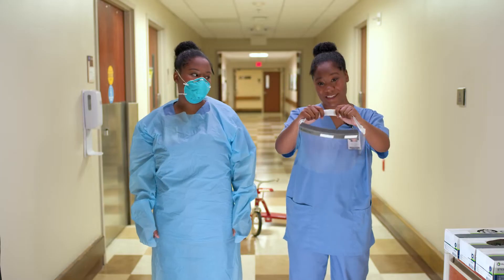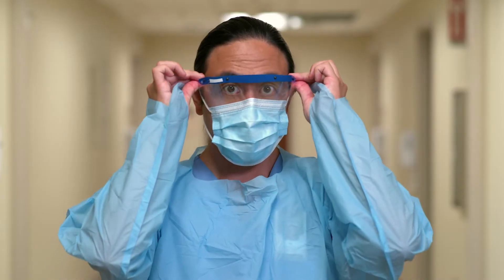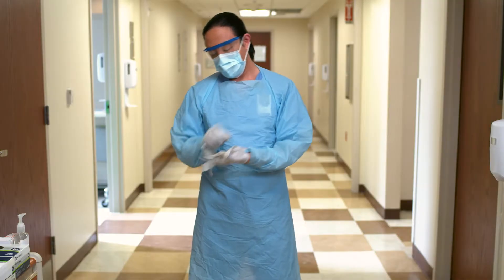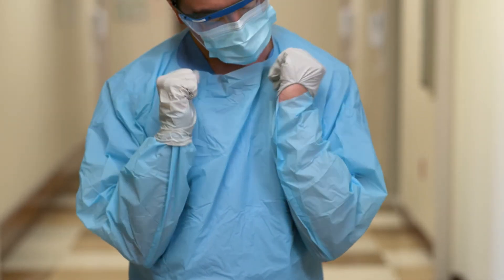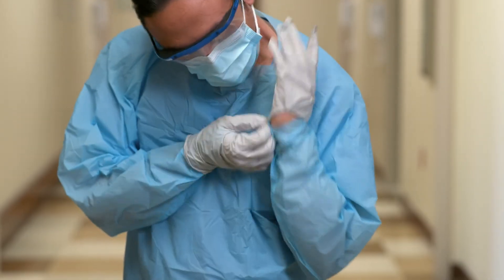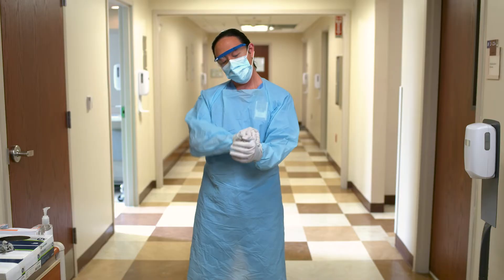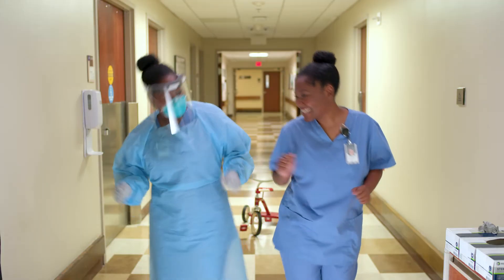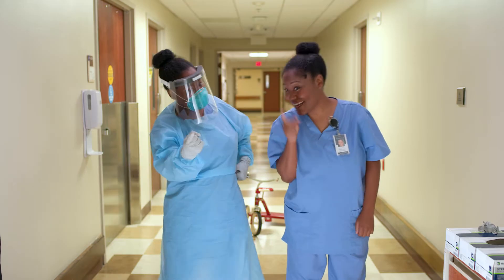Next, put on eye protection. And lastly, don gloves. Make sure the gloves cover the edge of the sleeves and that there is no exposed skin at the wrist. Victory dance! Go get him, tiger!